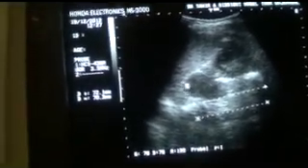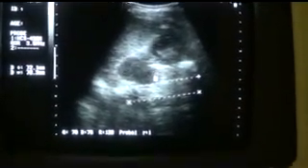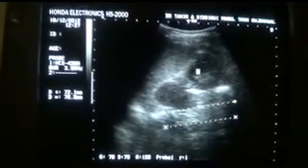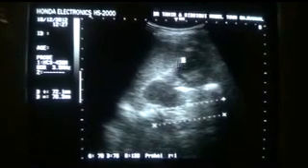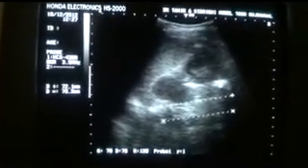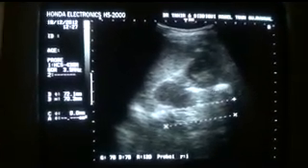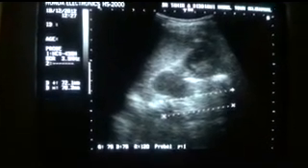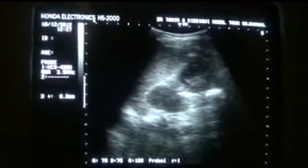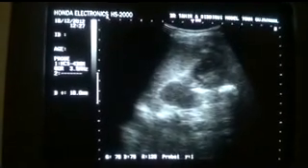This is one pocket of loculated hypoechoic area with posterior wall enhancement. This is another one, which is at the upper pole of the left kidney with internal echogenic areas, and this is the calculus that is in the renal pelvis that measures approximately 16 millimeters or 1.6 centimeters.